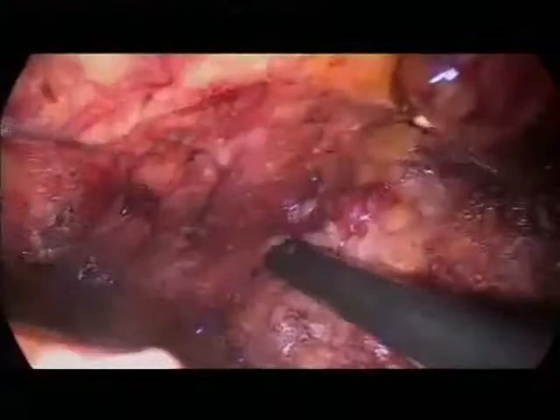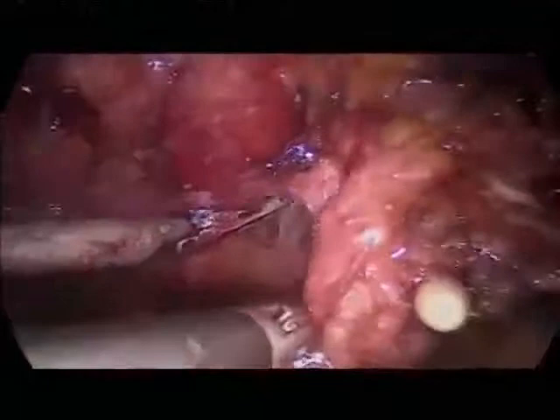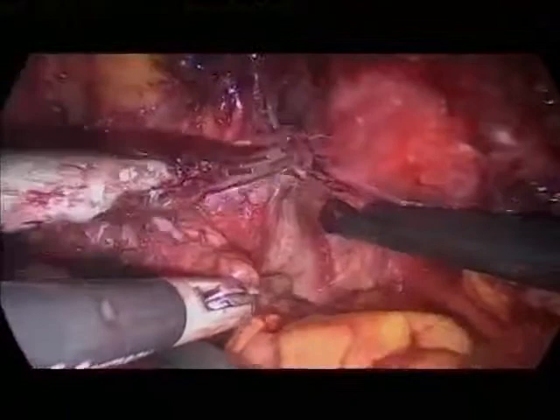So you see, we have incised here the endopelvic and periprostatic fascia. Here, go back a little bit. You see, this is the puboprostatic ligament, and we try to preserve it. We have made an incision here on top of the prostate on this side, and then the same on the other side. This is the prostatic capsule. You can see, this is the puboprostatic ligament.